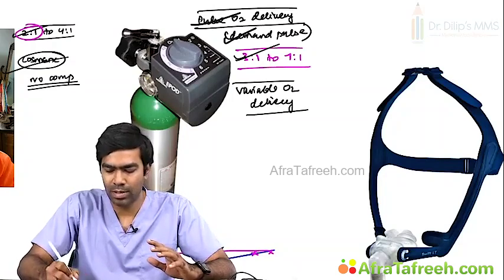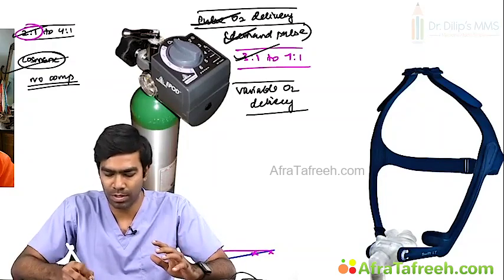There is no consistency among these device manufacturers. That's one problem with them. For example, in India we very commonly use this ePod device. We have Helios, we have Respironics. So many devices are coming. These are brand names, but all of them have variable oxygen delivery.